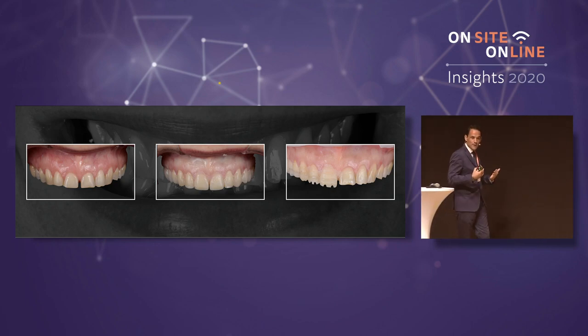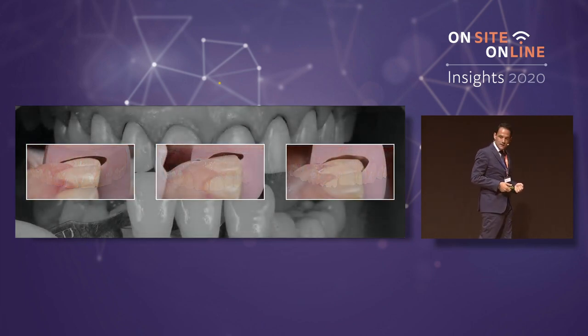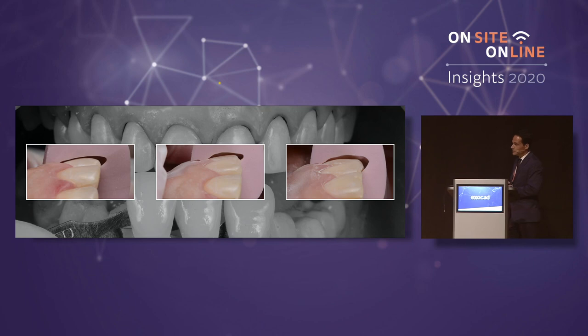We can see the result, and the patient can say to us, yes, I like this smile, or I would like to change whatever. So we value the space. These spaces are enough to receive the feldspathic veneers we are going to design on this patient.